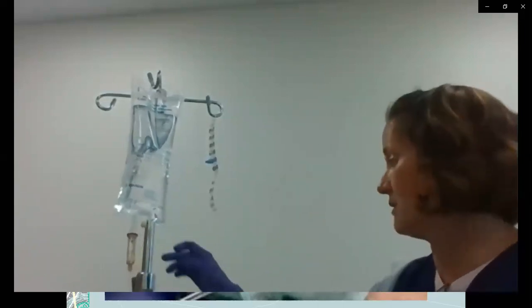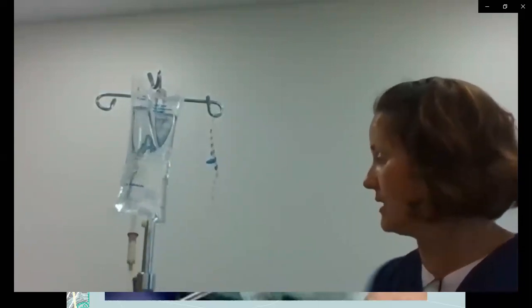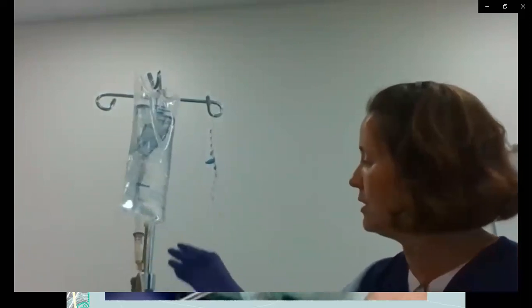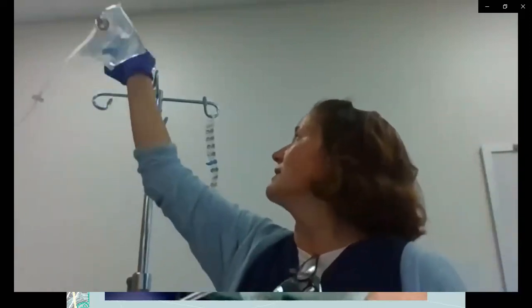That's going to tell us where we can see. We don't want it full, okay? Because if it's all the way full, would I be able to tell if this was dripping or not? No, I wouldn't. So now what am I going to do? Easy peasy. These things work great.